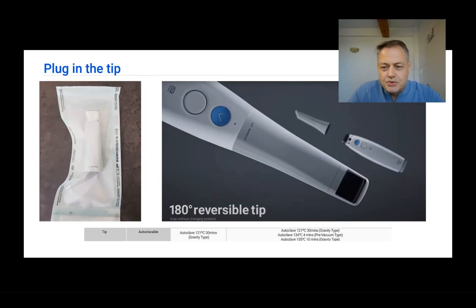Before starting to use the scanner, you need to remove the lid and place a tip. Tips can be used with the mirror facing down or up as you prefer — they are 180-degree reversible. Remember this because it helps when scanning the upper or lower arch.